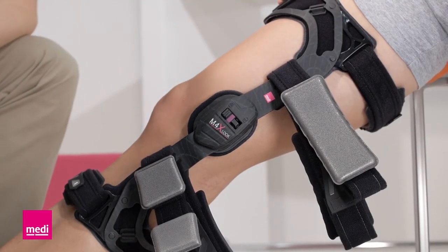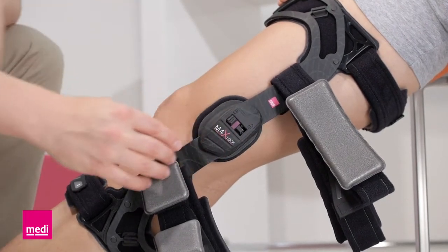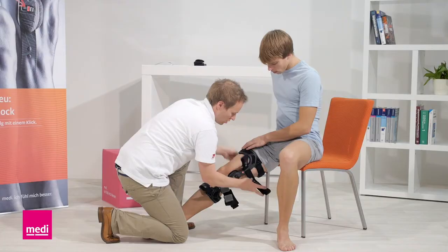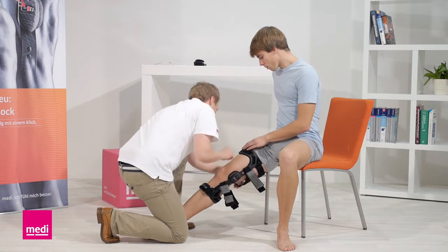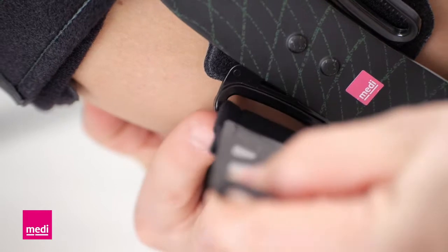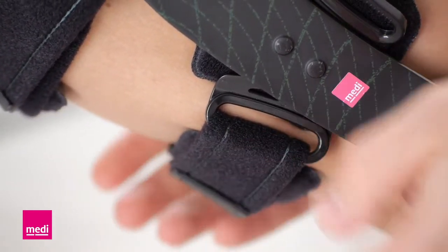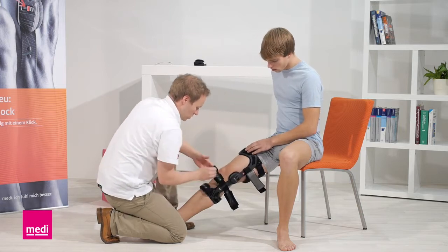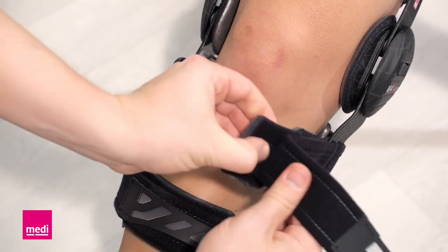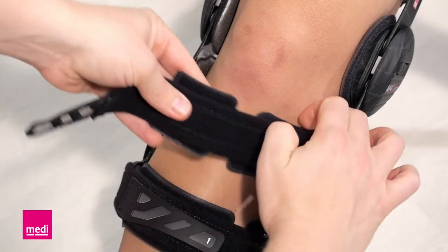Now, push both orthosis hinges backwards towards the back of the leg. Make sure that the hinges are positioned behind the lateral medial midline of the leg. Now fasten straps 3, 4, 5, and 6. Please note that the pads on strap number 4 are split. These can be positioned around the scar if need be, to avoid unnecessary pressure on a possible surgical scar.